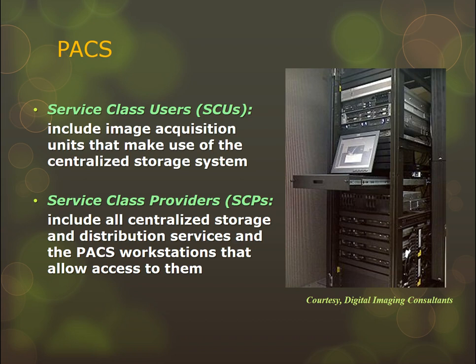So anytime two DICOM devices, applications, servers, are communicating, you always have a service class user and a service class provider, and the conversation goes something like this. They get together, the user will ask the provider, do you speak DICOM? The provider will say, yes, I speak DICOM. The user will say, can you store my images? The provider will say, yes, I provide that service. I can store images. And so once they talk to each other in DICOM, find out they speak the same language, then the user will request the service from the provider. That's SCUs and SCPs.